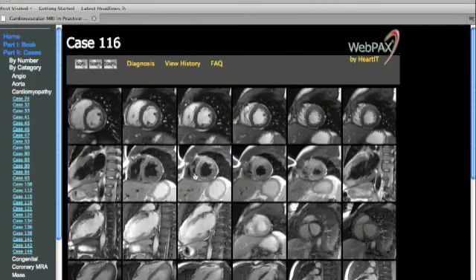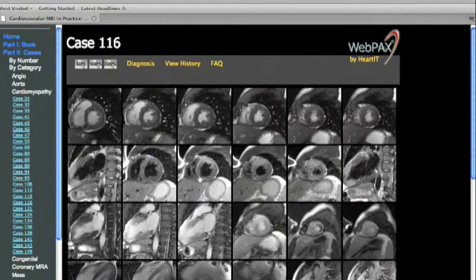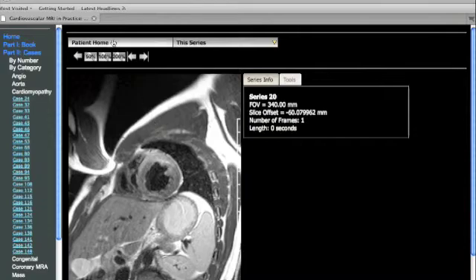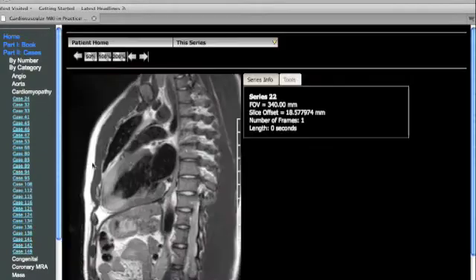The second row demonstrates T2-weighted images, which again demonstrate high signal in the anterior wall at the mid-ventricular level, extending, as you can see on this two-chamber T2-weighted image, to involve the apex.